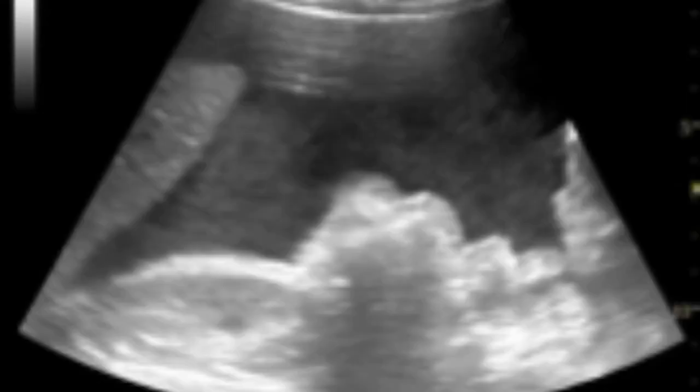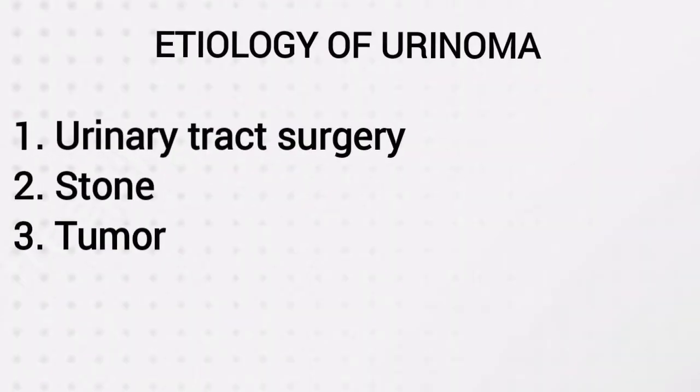And this is an example of hemoperitoneum. You can see floating bowel, the liver is separated from the right kidney and pushed aside. Now, urinoma, the etiology is urinary tract surgery, stone, tumor may cause rupture of the urinary outflow tract and collection of urine in the potential spaces.